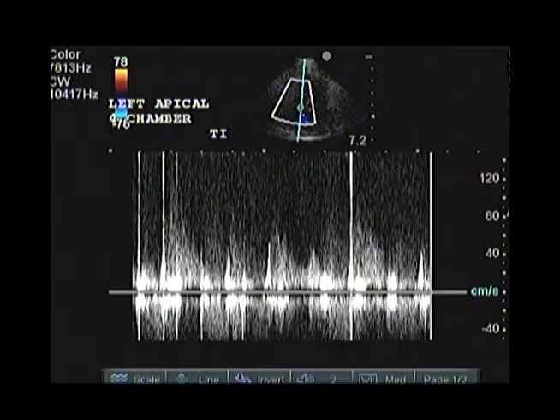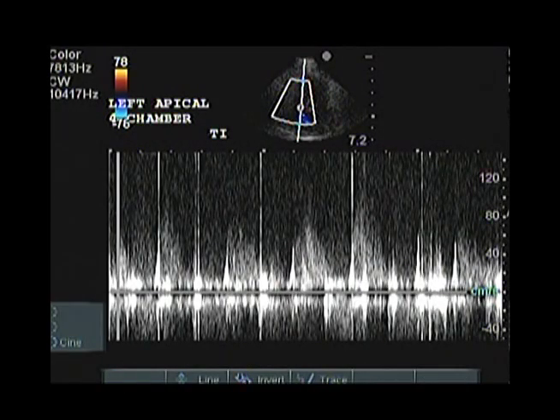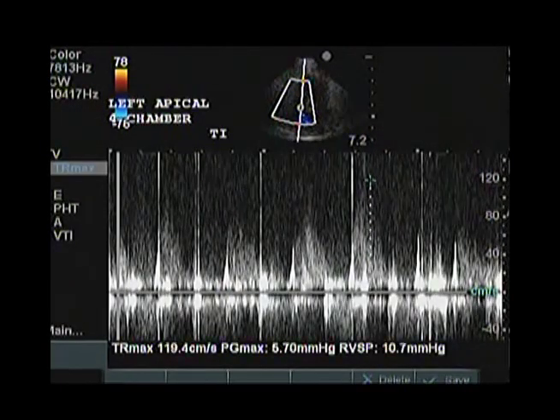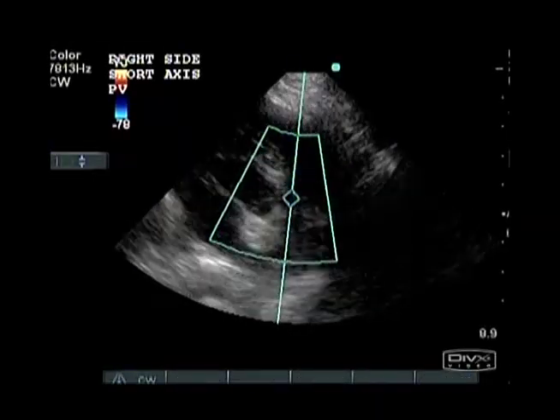Diastolic insufficiencies of the aortic or pulmonary valves are significant only if they cause an increase in the size of the left or right ventricle. The pressure gradient can still be useful by indicating the pressure difference on both sides of the valve. This dog has a pulmonary stenosis and insufficiency.